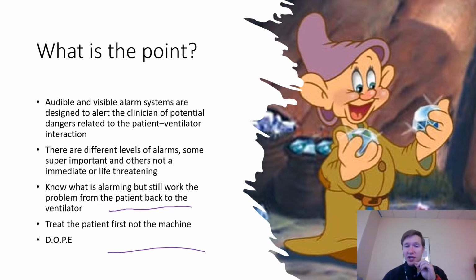Sometimes if the endotracheal tube moves out a little bit, like if the patient's moved around, the endotracheal tube cuff can herniate over the tip of the tube a little bit and cause a little bit of an obstruction there. You could also see it where there's a ball valve effect that could happen with secretions or other things at the end of an endotracheal tube, where gas gets delivered and then on exhalation it closes off. It creates a one-way valve, sort of like a ball valve effect there. So that's something else to look at. Is there an obstruction of the tube?